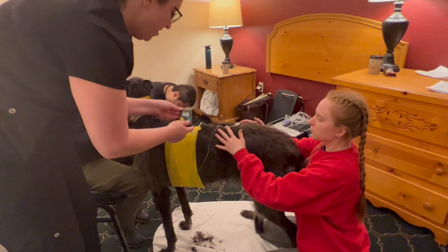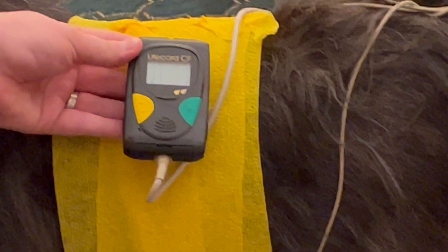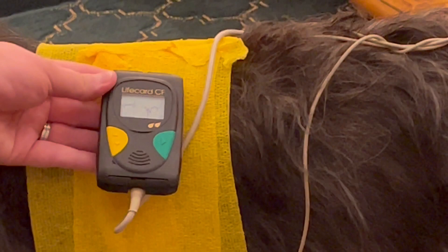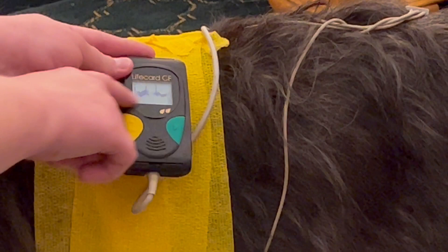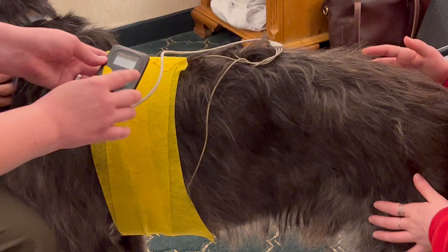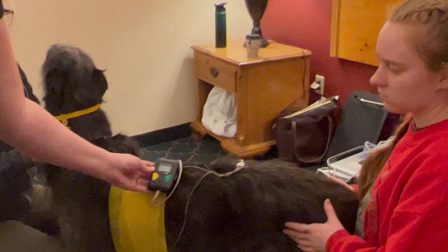What we can do to make sure we have good contact is check if the patient's ID is written on the label — you say yes, and then it'll show the recording. So we'll make sure we have reasonable contact. There is my lead to ECG — I can see there's actual QRS complexes. QRS complexes look a little bit upside down, but that's okay because we're going for rhythm here more than anything else. If it looks really blurry, like some of these channels do, that's a contact issue, so using a little bit of gel will help eliminate that. I hit the green button, say start now, and then it'll start the recording — it's for 24 hours.